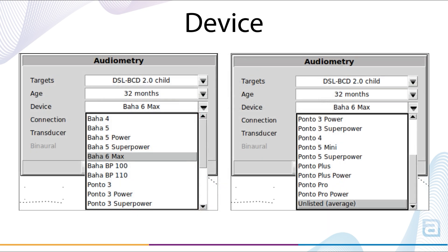Device sets the bone conduction device that the patient is fit with. Select various BAHD and PONTO hearing devices to set DSL-BCD 2.0 prescriptive targets based on the device's amplification characteristics, or select the newly added unlisted average option for instances where a device is not on the list or average device transforms are required.